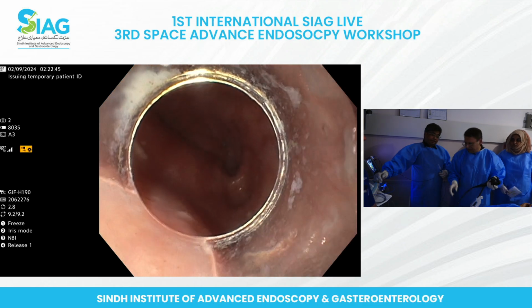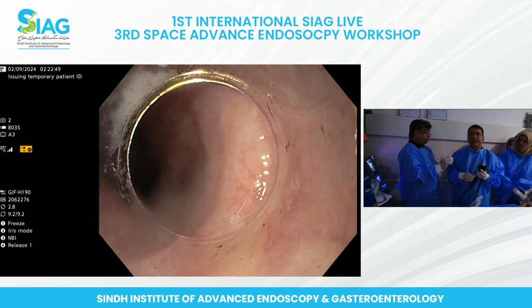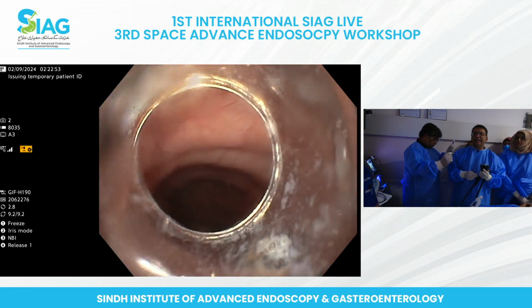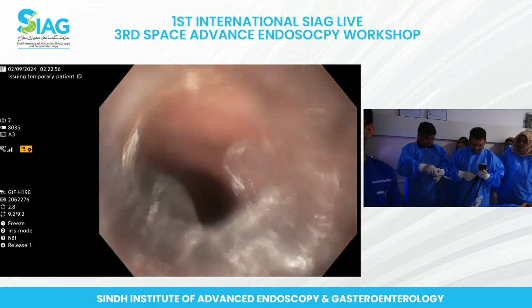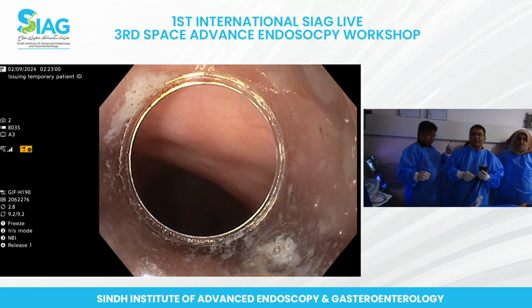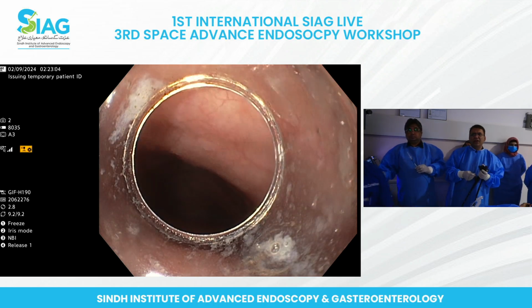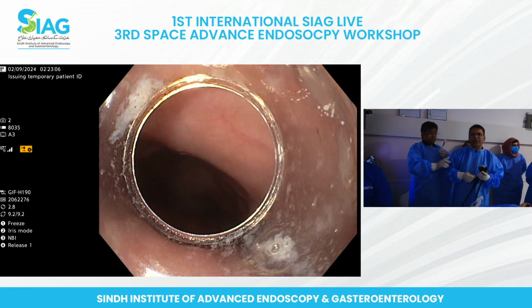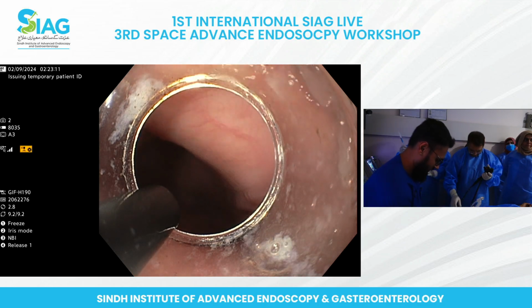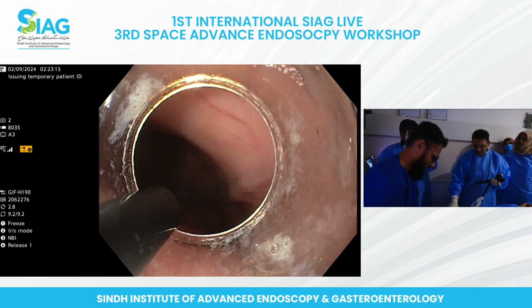This is good right here. I start injection with the needle. Okay. Yeah, Farooq does the same too? Yeah, okay. You start with injection and then cut and then get into it. Now, there is a way to do it even with the RB jet too. You can just put that directly on that, do a little bit of cut, but I think that's not the proper way to use it.